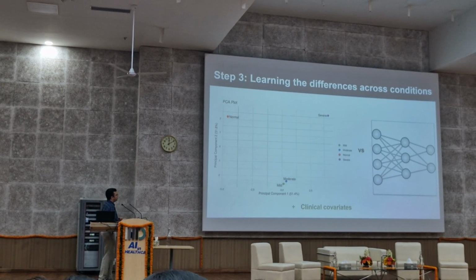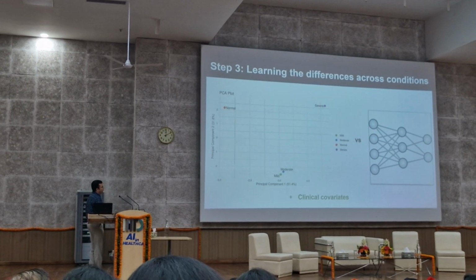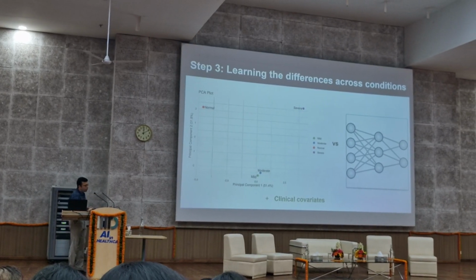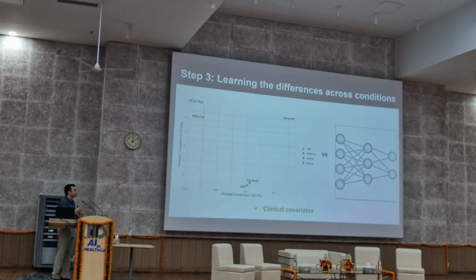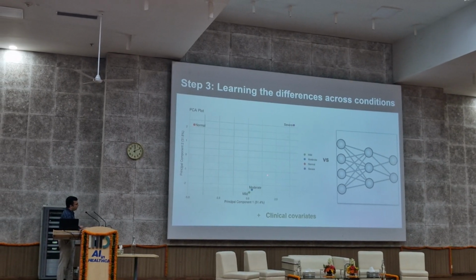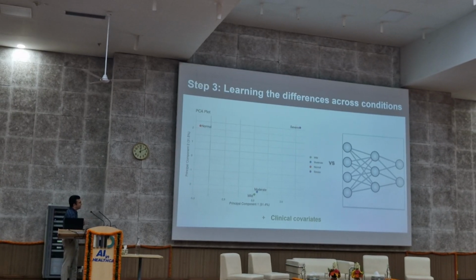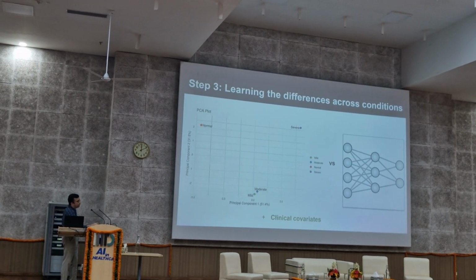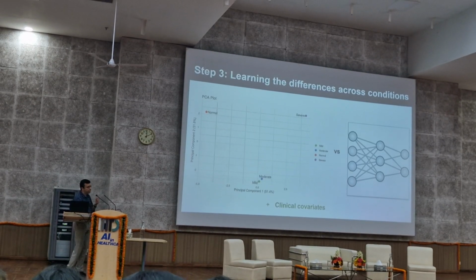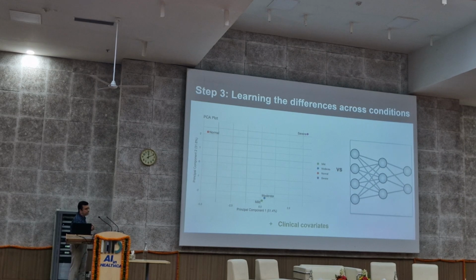Fine. So the first thing that we did once we looked at this kind of data, and this is very preliminary, is ask whether there is enough signal in just a few of the channels. I'm not showing you the name of those channels, but there is information in this data. Even if you take these average values across these 8 hours, you can separate out the severe cases from the mild, the moderate and the normal cases, which means that there is enough signal in just a couple of channels which helps you separate out these cases.